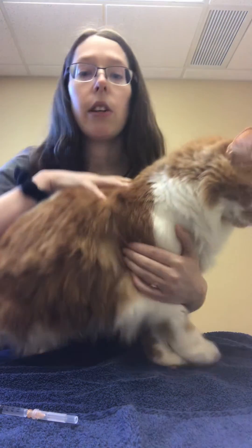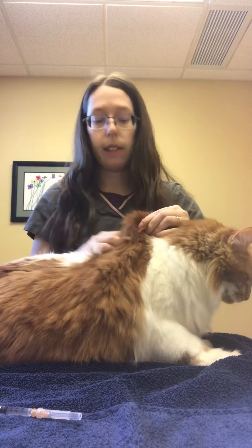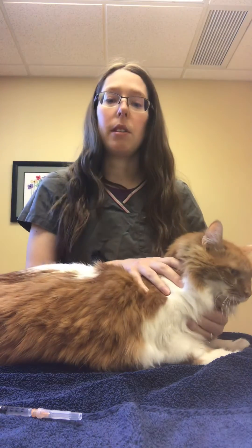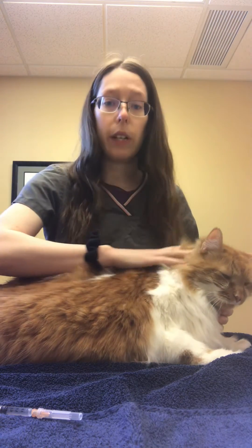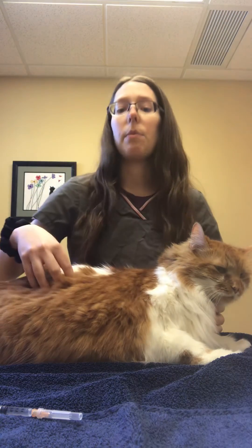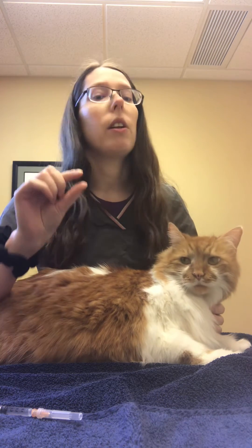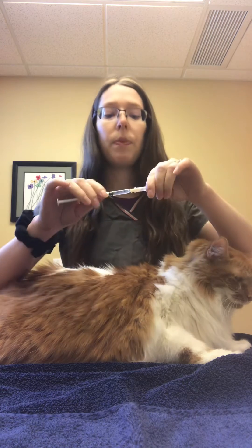Now, for any injection that you're going to give at home, injections go in the shoulder area, the same place you would do subcutaneous fluids. The only injection you're not going to give in this spot is insulin, because this area is so thick — the scruff is so thick — the insulin isn't absorbed as well here. So you're going to want to give it down lower on the side, on either side. Sometimes we'll shave a spot for you for the insulin, because that insulin needle is so tiny you don't want to miss. Every other injection though is going to go in the scruff area, the shoulders.